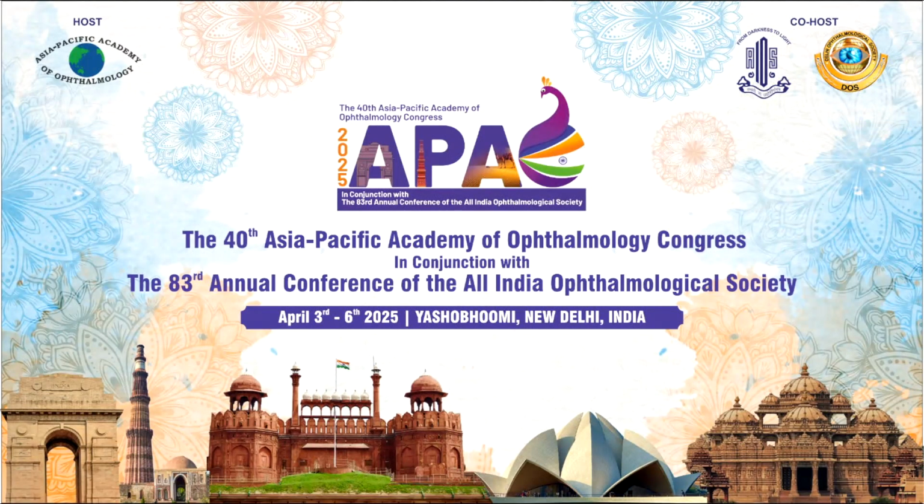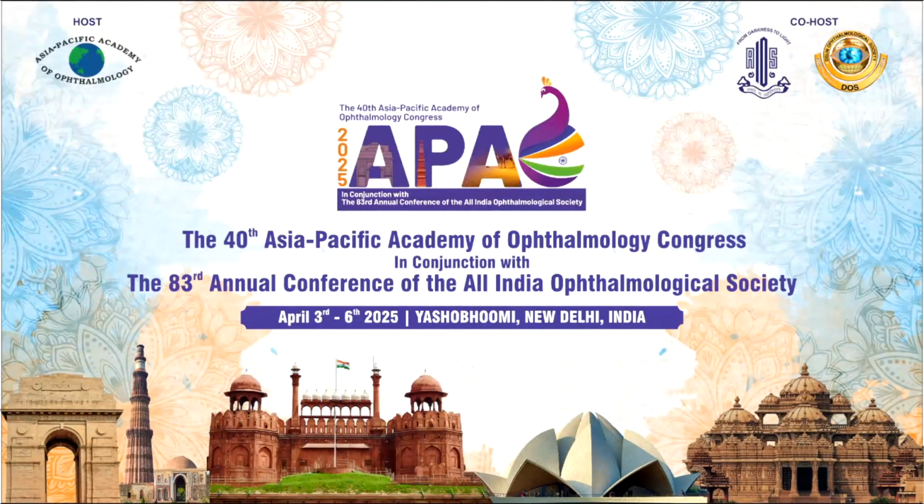So how extensively do you use OCTA in your management of DMEs? Yeah, that's a very good question. In DME, not much, but one application of OCTA I found in diabetics was when there's unexplained vision loss and it is not correlating to the OCT.